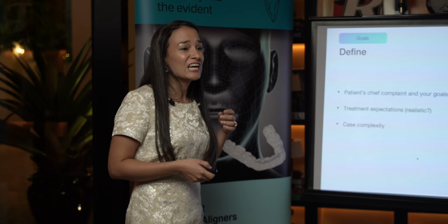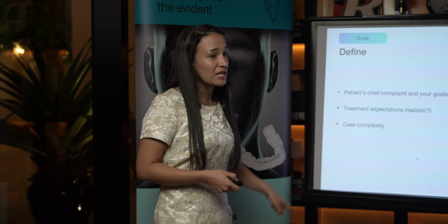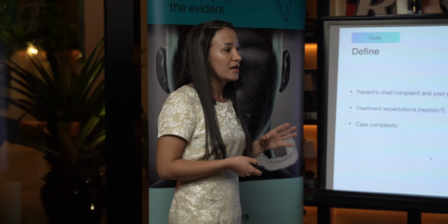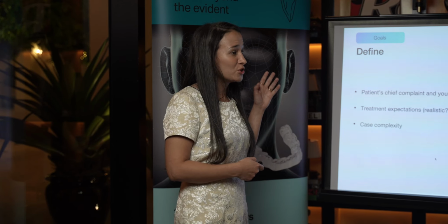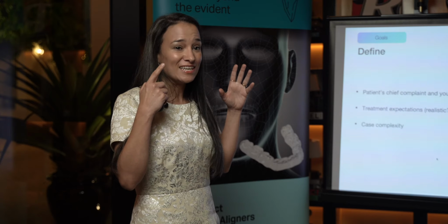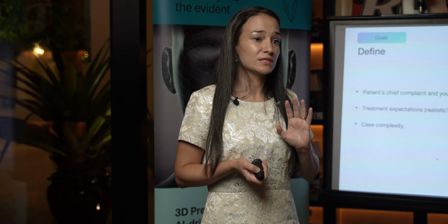And she said, oh, it's actually number 7. Number 7 is pushed back. So when the patient smiles, her grandkids tell her, Grandma, you have a crooked tooth. And the patient was just upset about it, right? And I said, well, we're moving posterior teeth. What are we doing moving posterior teeth? We should be focusing on the social 6, right? Canine to canine. So let's align those social 6 teeth. And then your patient is going to be happy. What are we doing correcting the class here? And we're going to talk about that too in a second.